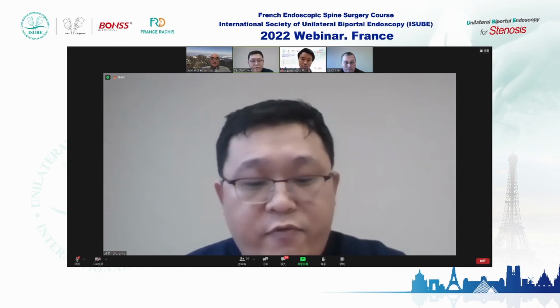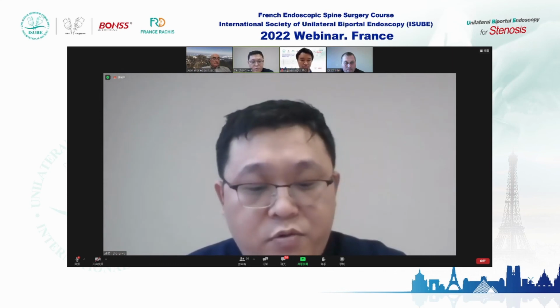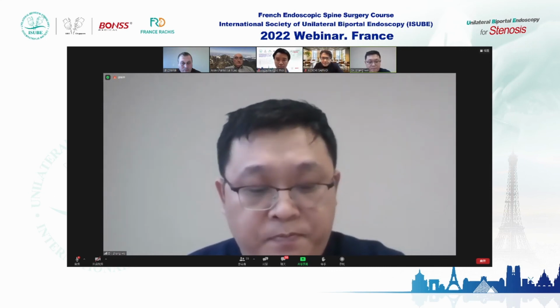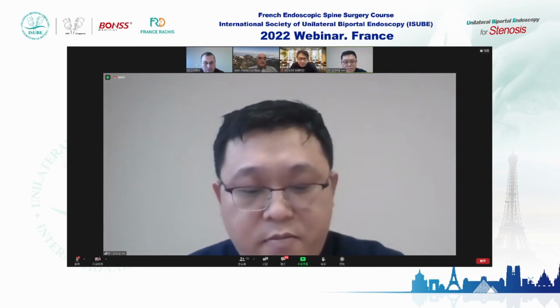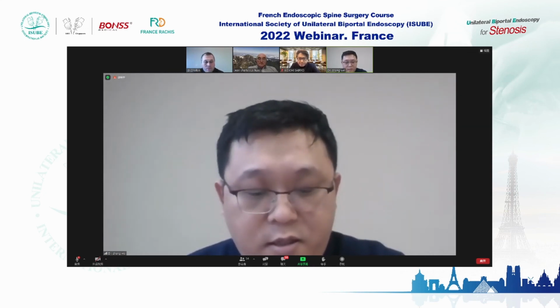It's a great time for surgeons worldwide to gather together to share their knowledge about the minimally invasive technique of UBE. How to achieve the best outcomes of minimally invasive spinal surgery is the most focused issue among surgeons. Thanks to the development of spinal techniques, there are more and more options in minimally invasive techniques, including the UBE technique, uniportal endoscopy, etc.